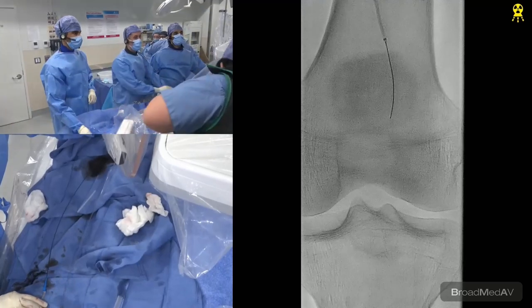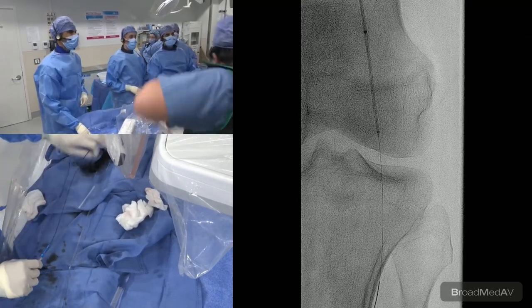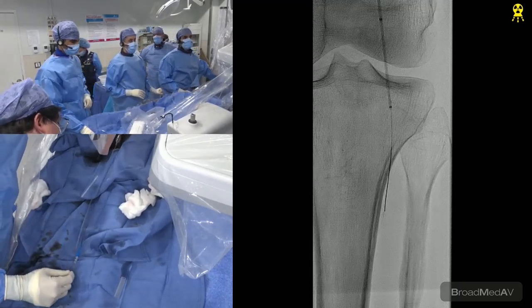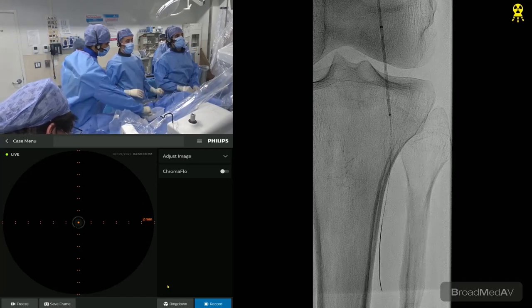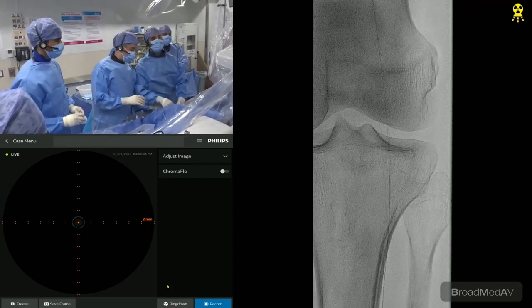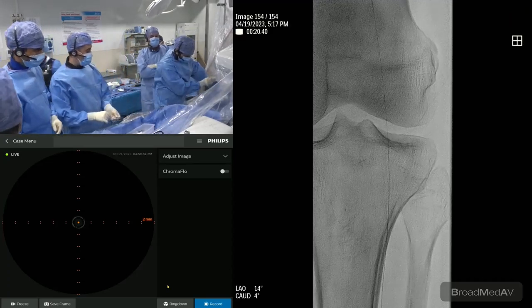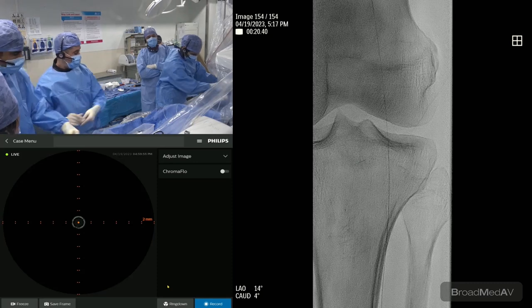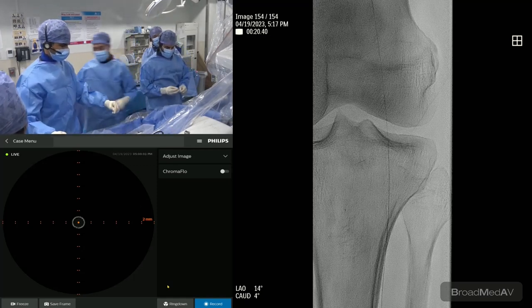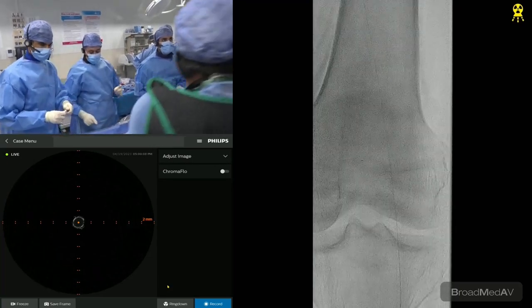So we knew that this would not be a challenge crossing. But what I really want to look at is what are you going to treat and how are you going to treat it? So once he crosses, Raman, how would you assess what you're going to treat? Obviously, you're going to fix this. Let's do an IVUS and look at the lesion first. So we're going to leave the Command wire down in one of the vessels, probably the peroneal is what Raman has chosen. And then we're going to walk this out, and then we're going to take a DSA to take a look. So this might have been a lesion that was 99% for a long time, broke down, maybe embolized something from the aorta, and then became 100%. So we will now take a DSA of this particular vessel where they cross to see whether it's thrombotic or not. So show me the DSA, Vishal.